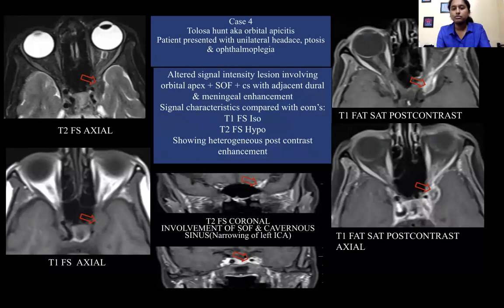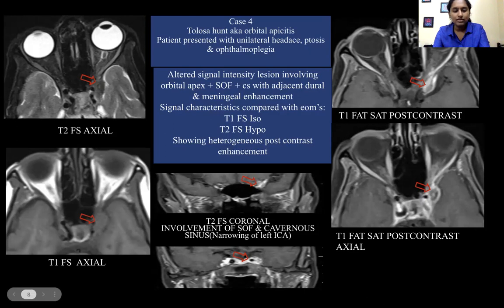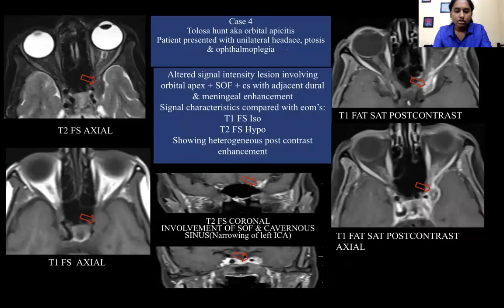This patient presented with unilateral headache, ptosis, and ophthalmoplegia. On imaging, an altered signal intensity lesion was seen in the orbital apex, superior orbital fissure, and extending into the cavernous sinus, with adjacent meningeal and dural enhancement along the anterior temporal lobe. On T2 fat-sat images it was hypo-intense, and iso-intense on T1 fat-sat. T1 fat-sat post-contrast showed avid enhancement extending into the adjacent dura. On T2 fat-sat coronal images, involvement of the superior orbital fissure and cavernous sinuses was confirmed, with a narrowing of the left internal carotid artery also noted.